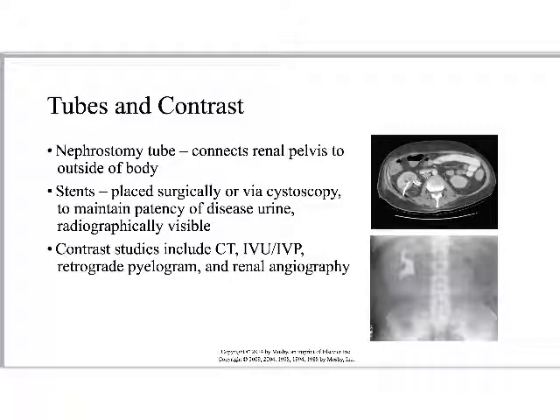If it's anything else going on with the kidneys, hydronephrosis, or we suspect some kind of ectopic kidney function or cancer or what have you, we do need contrast. So it's very common for certain renal protocols to do without and with, depending on what we're looking for. So that's the CT world.